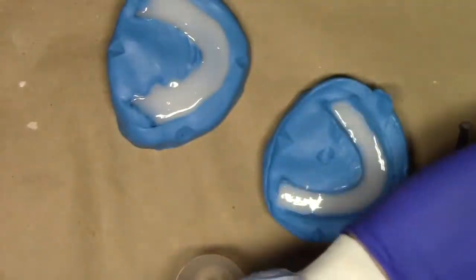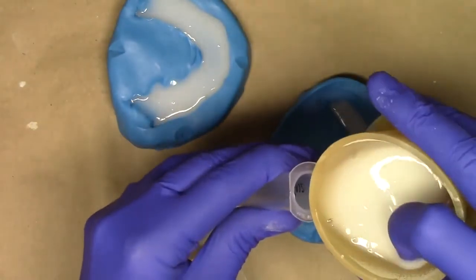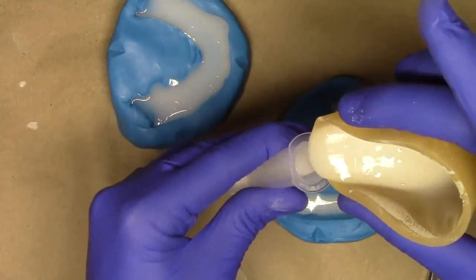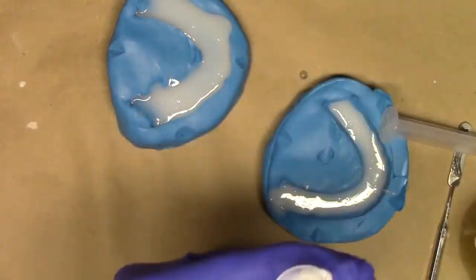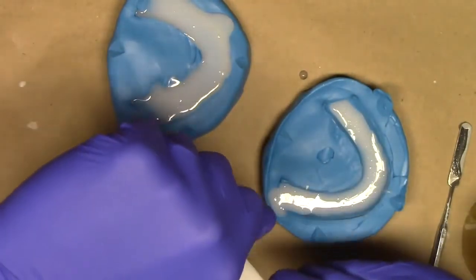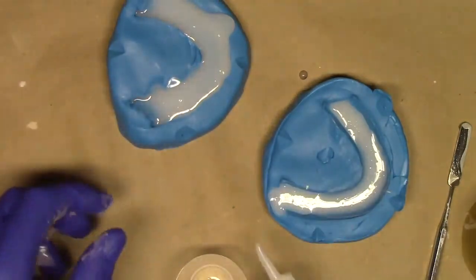Now, just as a safety feature, I'm going to take out my monoject syringe. That little piece of black out of there, good. And I'm going to pour this into my monoject syringe. And what this is going to allow me to do is create almost like an injection-like device. I put this top on here, being careful and mindful of this shooting. There we go. You have an air bubble pop up on you.